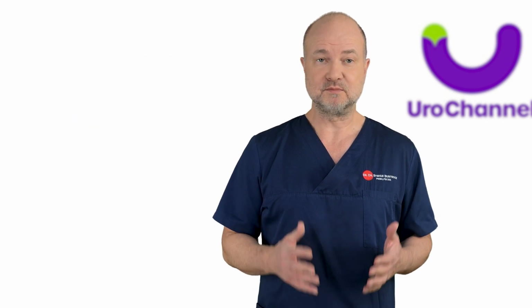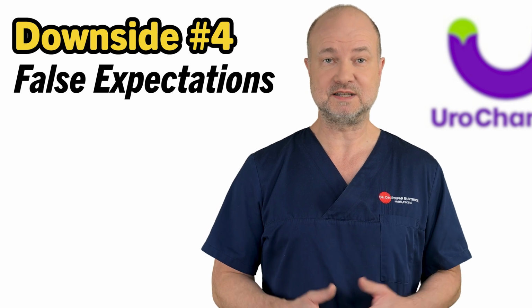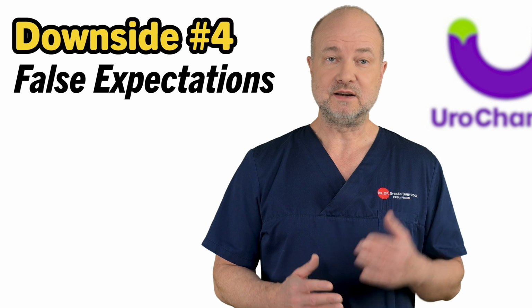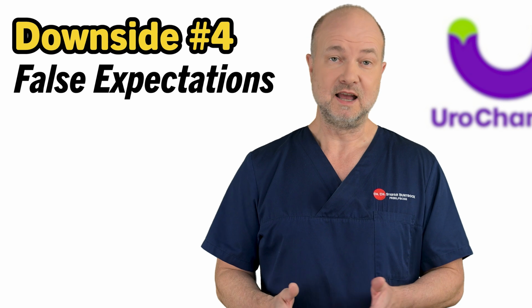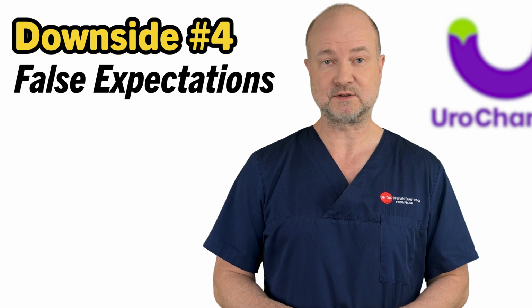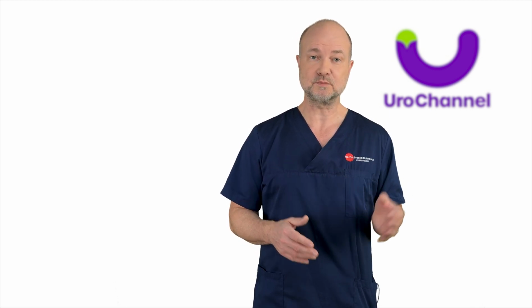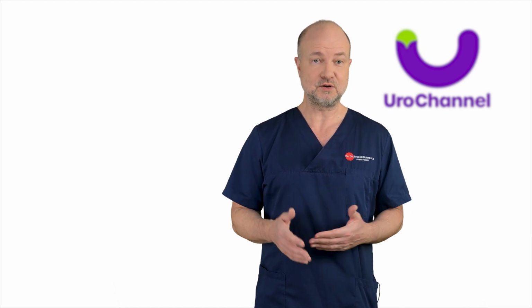I saved the most important point for last. Downside number 4 is exaggerated expectations that a prosthesis fully restores natural sexual function. After all, it is not the real thing, and even if erections become reliable, they may not be as expected. In some cases, orgasm may be compromised after prosthesis placement, and depending on surgical technique during the procedure, sensitivity issues may arise afterwards. This means if you are thinking about getting a penile prosthesis, you need thorough preoperative counseling on your personal circumstances to determine the right type of prosthesis and whether it could be the right thing for you at all.